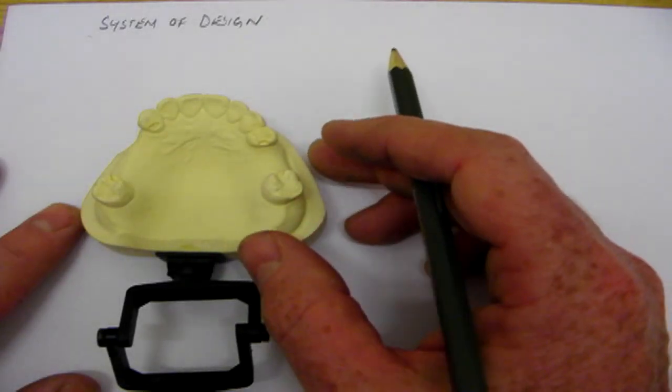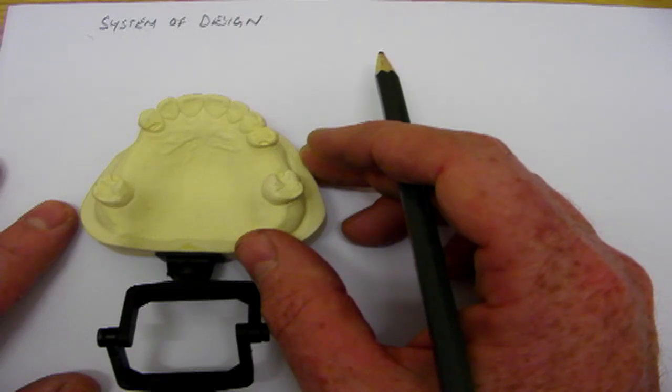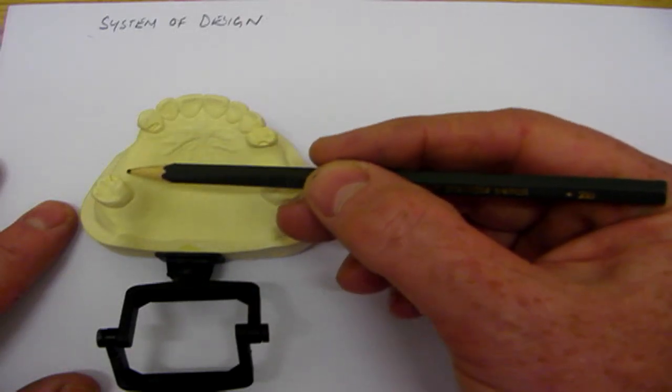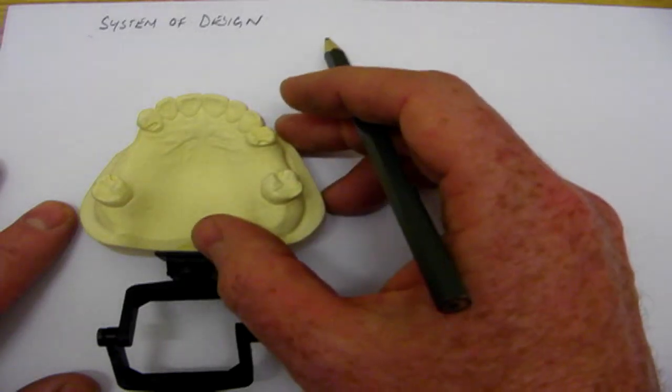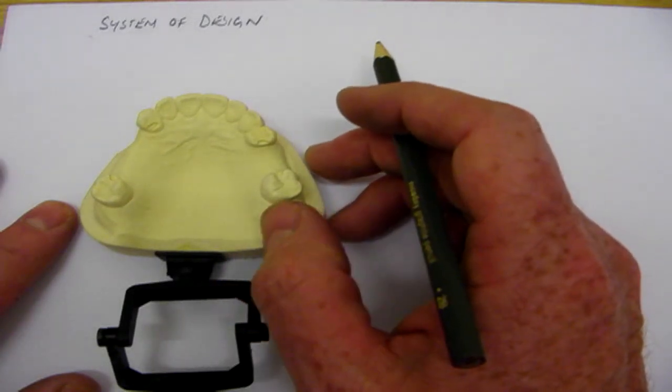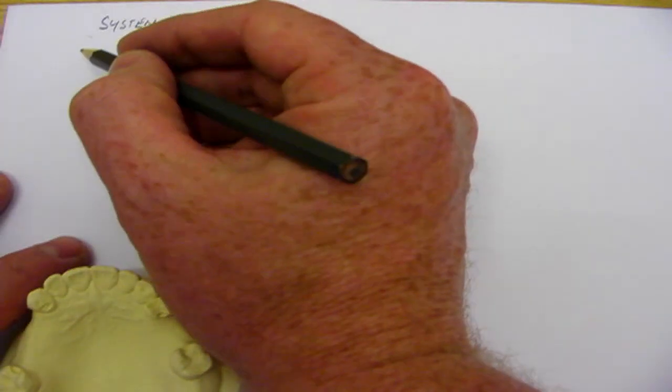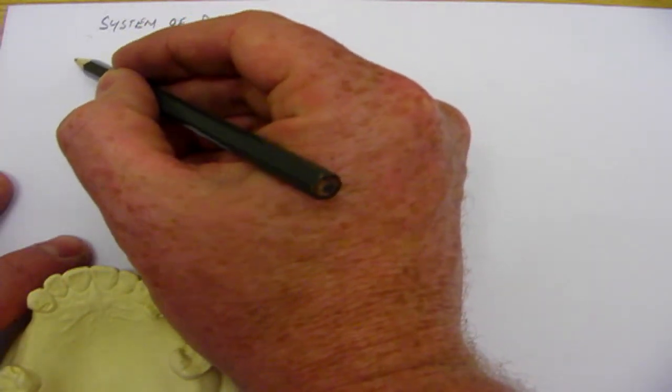We'd think about which teeth are significant to the design. So we've already made some decisions in our mind, and they are where the saddle areas are, where the teeth are going to go, and what type of denture we're going to make, so whether it be a mucosa borne or a tooth borne. So in our system of design we ought to really acknowledge that to start with.